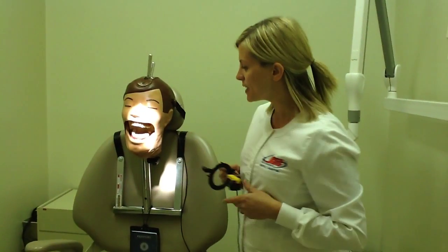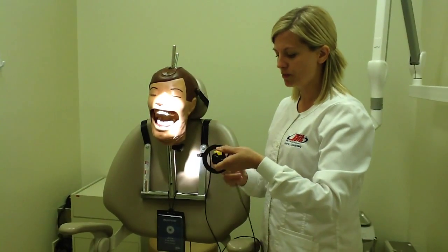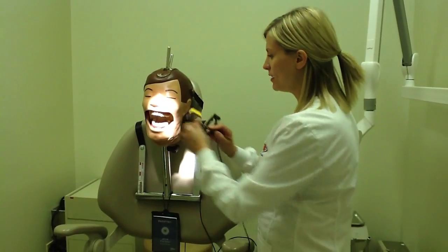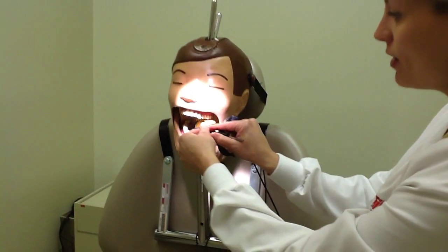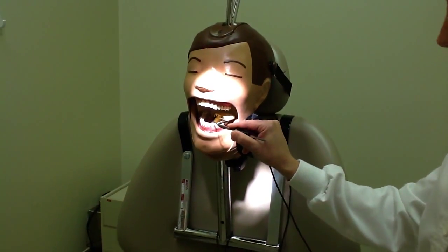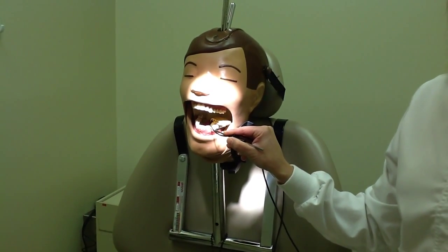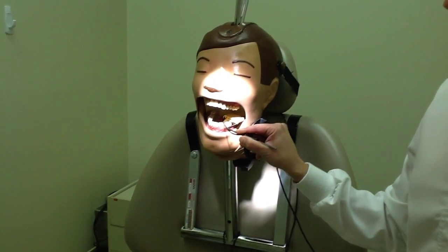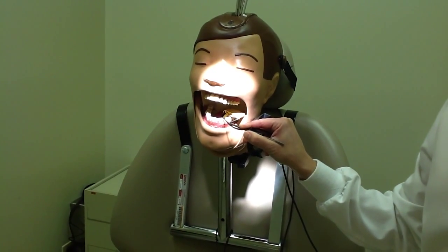Okay, so we have our 3/6 here. We see that the long axis is quite perpendicular to the floor, and that's how we're going to aim for the placement of our receptor. We're going to position the receptor lingual of the tooth, and we want to position it parallel. In a mandibular posterior PA, we will be positioning our receptor quite snug against the lingual surface.